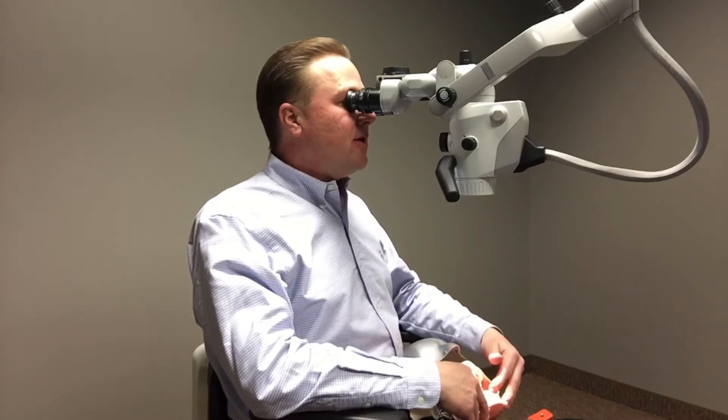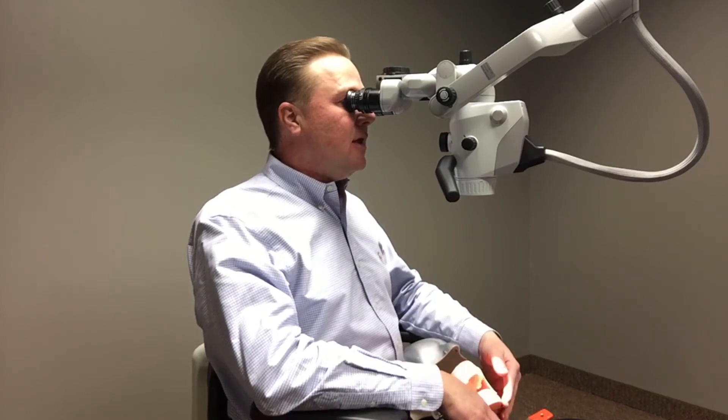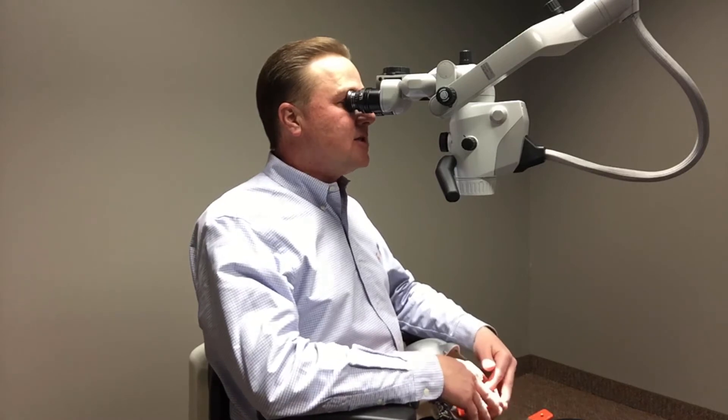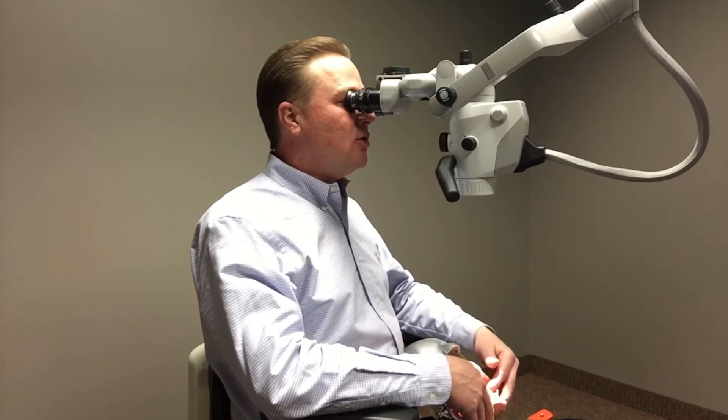You can see here, I have my patient simulator in the dental chair. And as I'm seated in the stool, and as I'm going through and performing my exam, my back and my shoulders are in good upright and parallel positions.